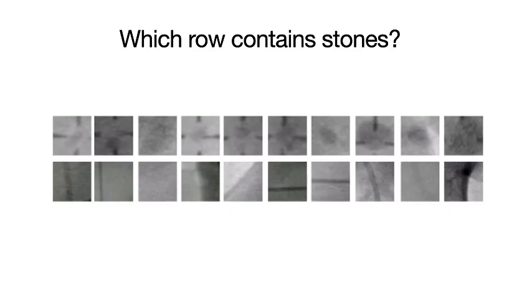Correct. Yes, stone images appear grainy in C-arm images, because we are monitoring stones in real time and aim to minimize the patient's exposure to X-rays. Now, let's discuss how we can compare the initial stone images with those taken after shockwaves.